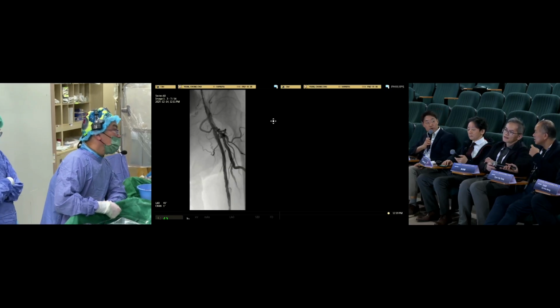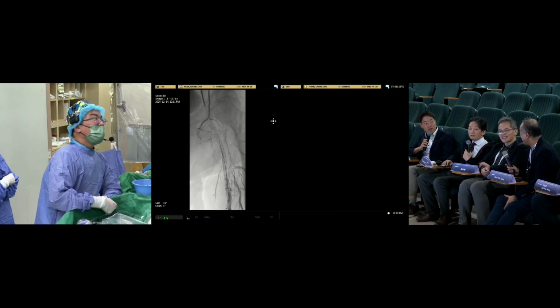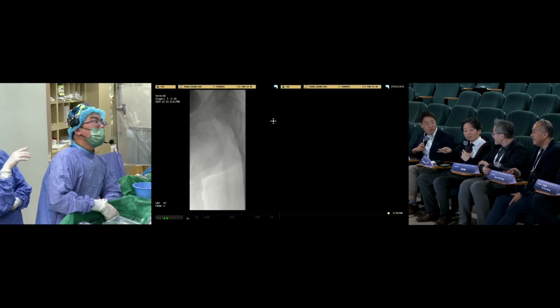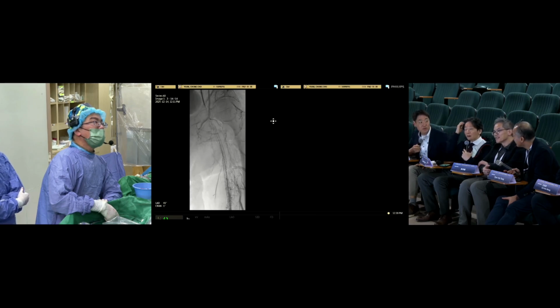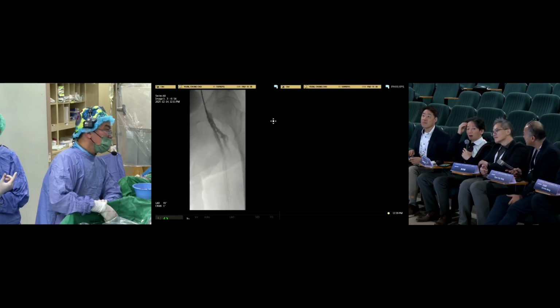But how comfortable are you placing a balloon expandable stent in a joint where it can get crushed? Not very, but you don't want to cover that profunda. Yeah, I'd prefer self-expanding. I have some concern about the deforming of the balloon expandable stent. Therefore, if I treat this region, I put the self-expandable.